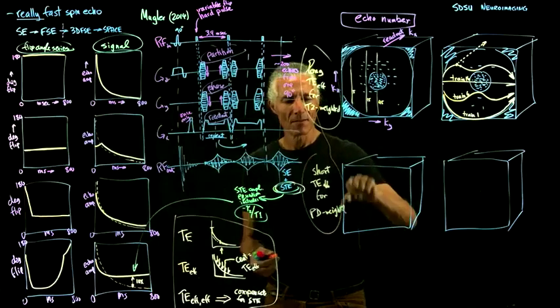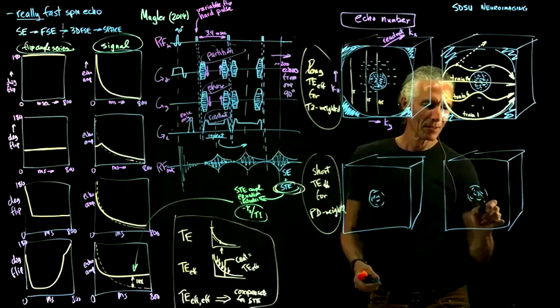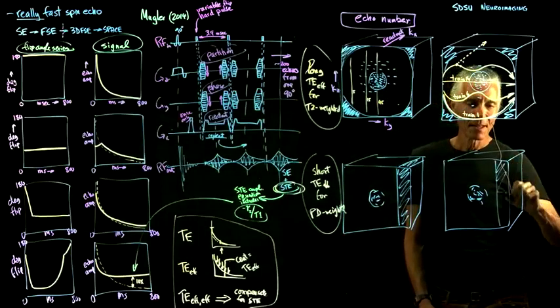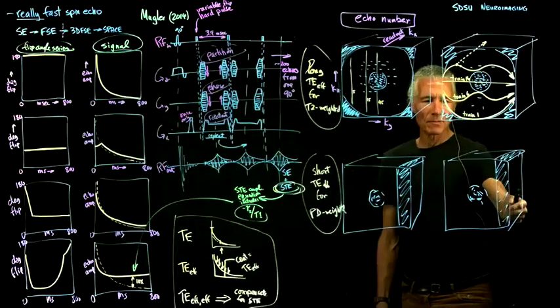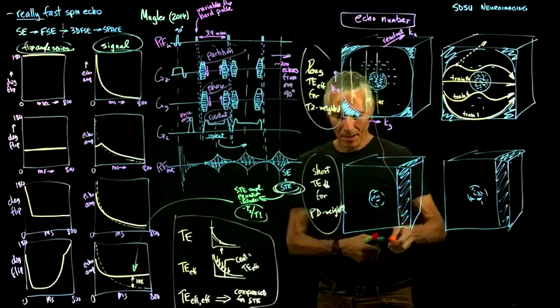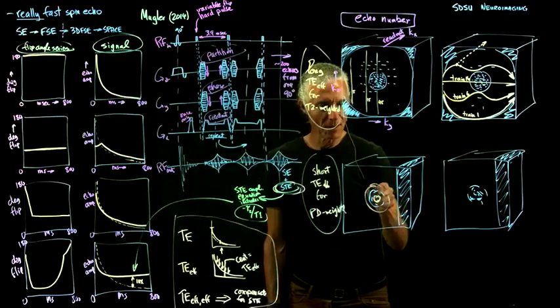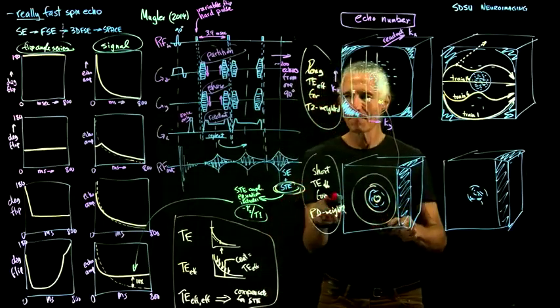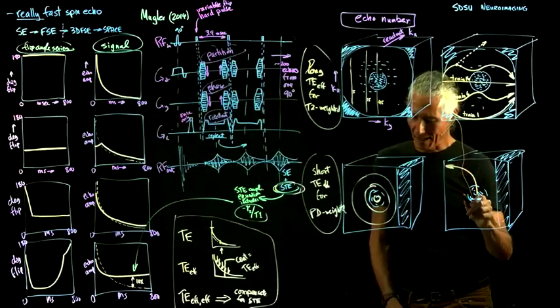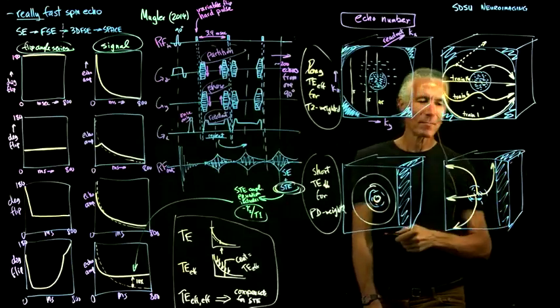And in this case, we're just recording more in the center of k-space like we were before. But in this case, we've got so much signal that we can just chop off part of k-space. So just don't bother recording this. And how could we do that? Remember, that was because of the funny symmetry of k-space. We can reconstruct what this data should have been from other parts of k-space because of the Hermitian symmetry. And then the way you're doing the echoes here is you start in the middle and then you go circularly through k-space because we want a short effective TE. And then the actual echo trains come out in a strange way like this. And they come up like that after chopping off some of the k-space.